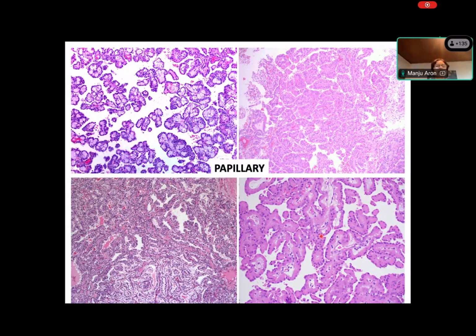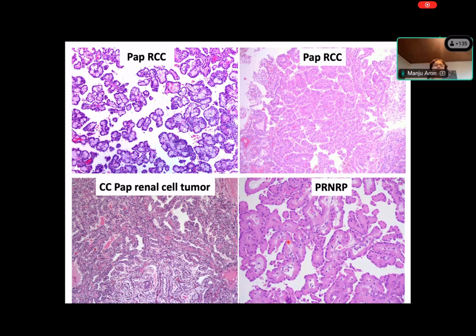Here are examples of tumors which are papillary, right? Here's one tumor which has papillae with a lot of macrophages within the core. Another papillary tumor with mostly pink cytoplasm lining it. Again, another tumor which has this tubular and papillary appearance, and the papillae have a very fine hierarchical branching. And again, another papillary tumor which has pink cytoplasm and nuclei away from the basement membrane, more peripherally placed nuclei. So these are all different kinds of tumors, and this is an example of papillary renal neoplasm of reverse polarity, PRNRP for short, and then this is an example of a clear cell papillary renal cell tumor.